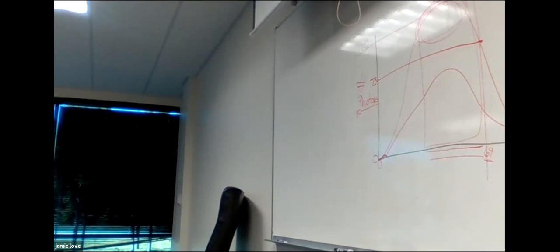So by changing our kVp, we changed our number of photons, because more photons can make it through at higher kVp, and we raised the average energy of our beam because our kVp was higher. So that's what we're looking at on the charts, what changes and what these little things can do. We're not going to look at phases and generators because that's in your next class.